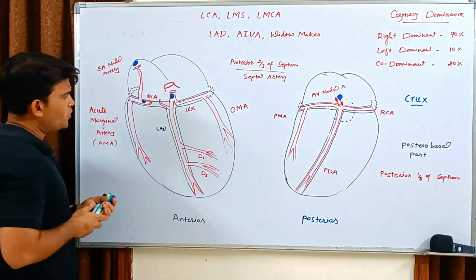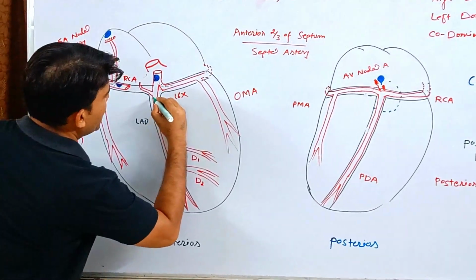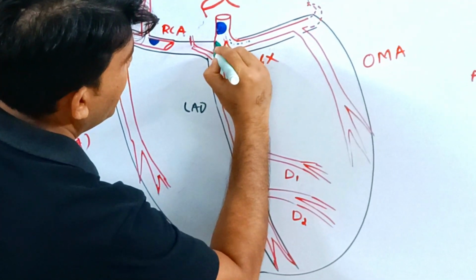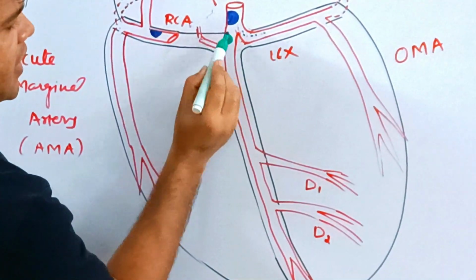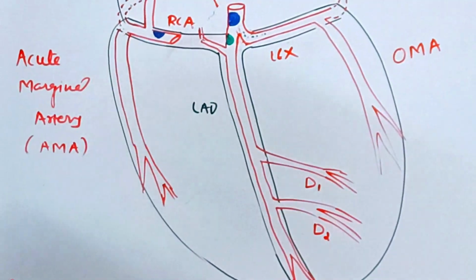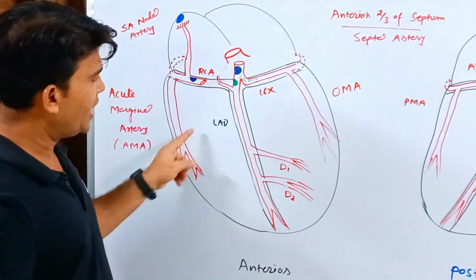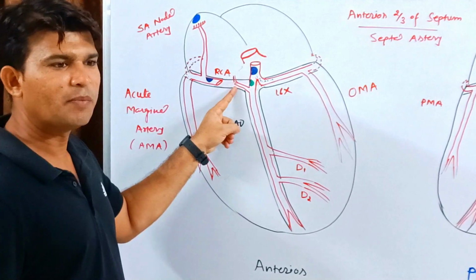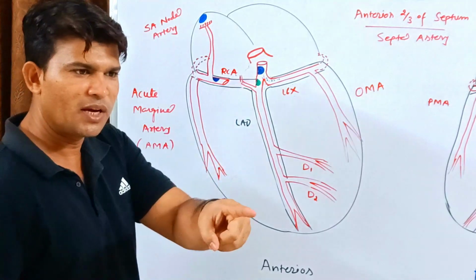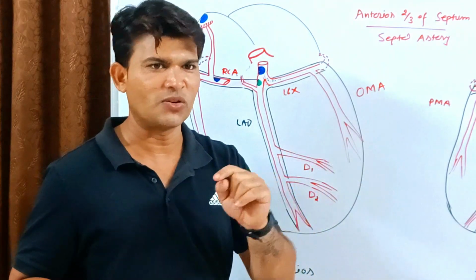Okay. Second possibility: if the patient has an atheromatous plaque in this area, and a hemodynamic event occurs, and the LAD is completely occluded, what will happen? The patient will develop a large anterior wall MI with the septum. In this case the patient will develop an anteroseptal wall MI, and you will see changes in V1 to V4. Am I making sense or not?